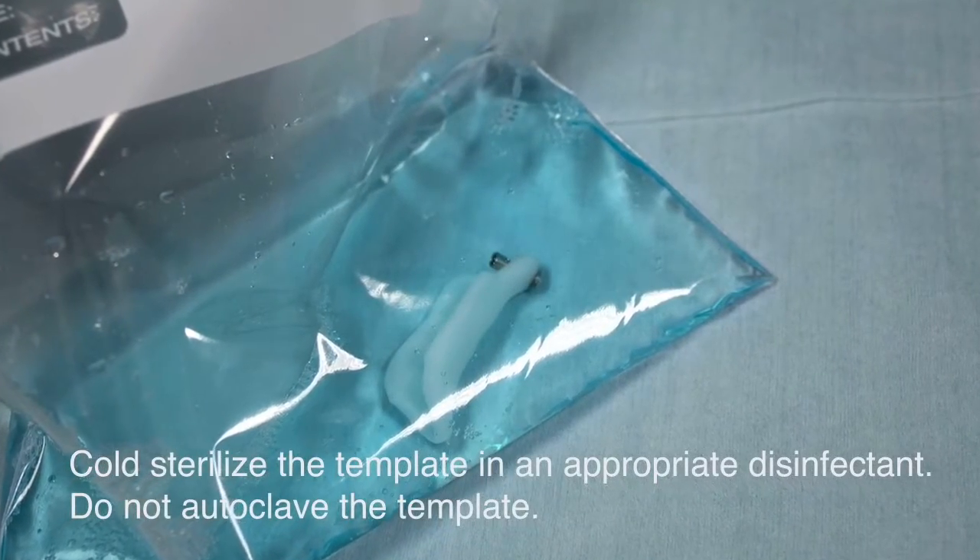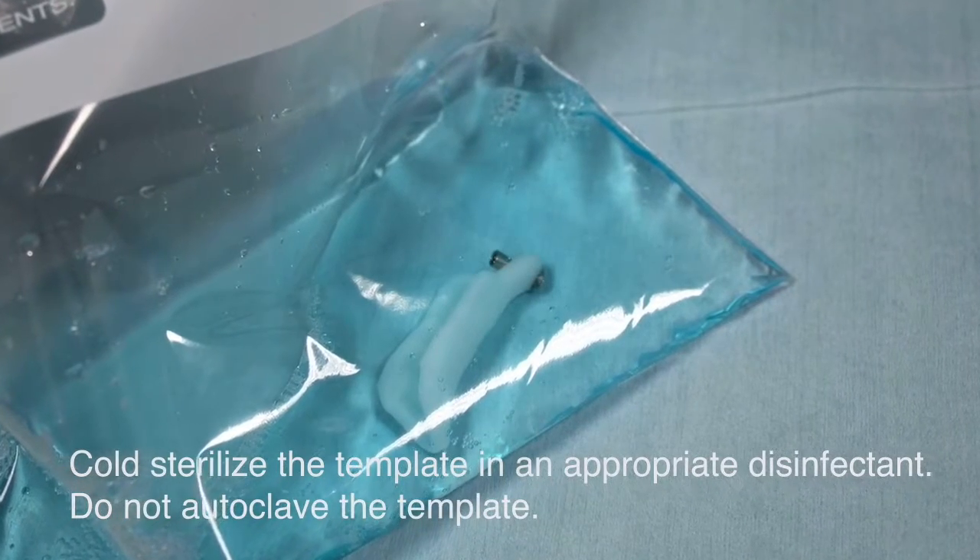Cold sterile the template in an appropriate disinfectant. Do not autoclave the template.